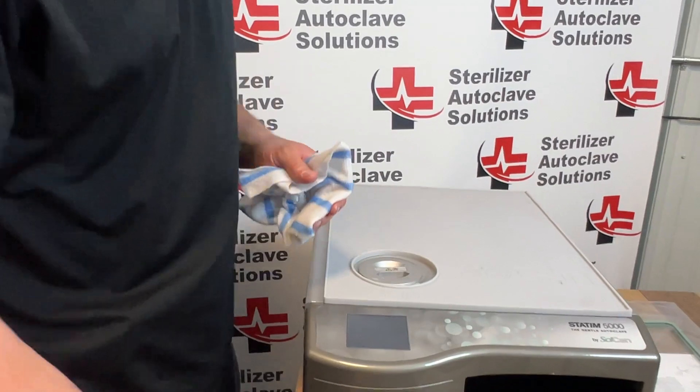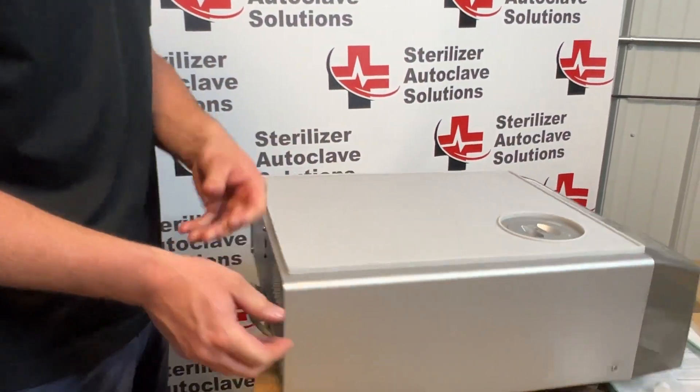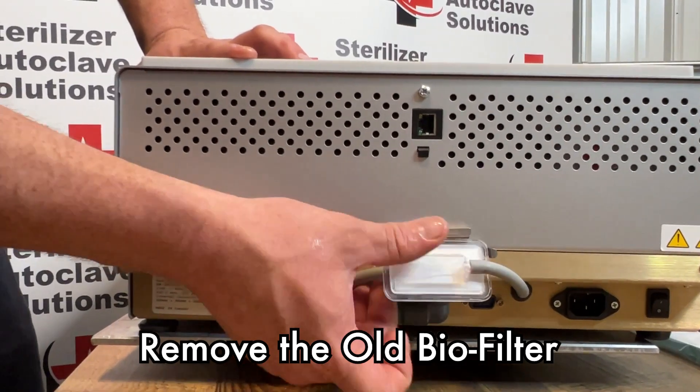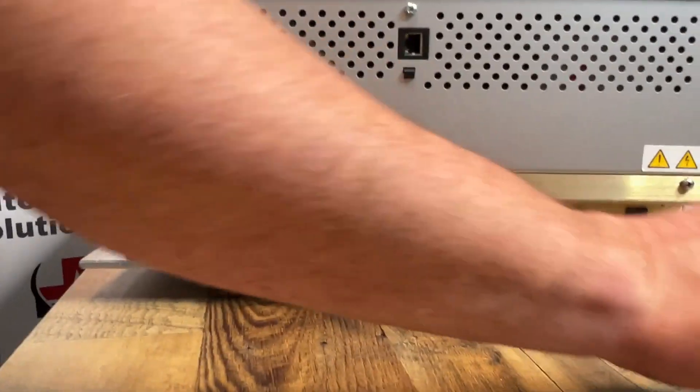I'm going to set this off to the side. We're going to move on to the back of the unit. At the back of the unit you have your biofilter right here and we are going to remove that and set that off to the side.